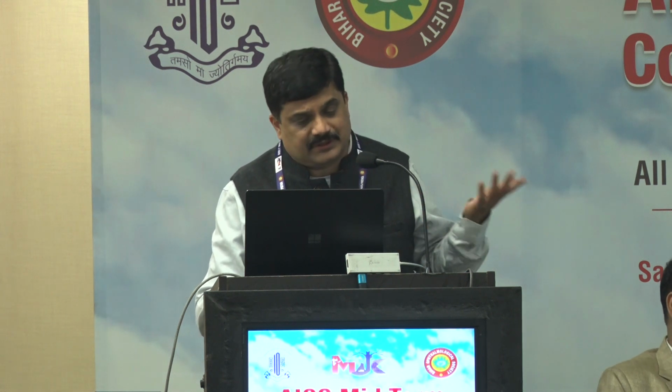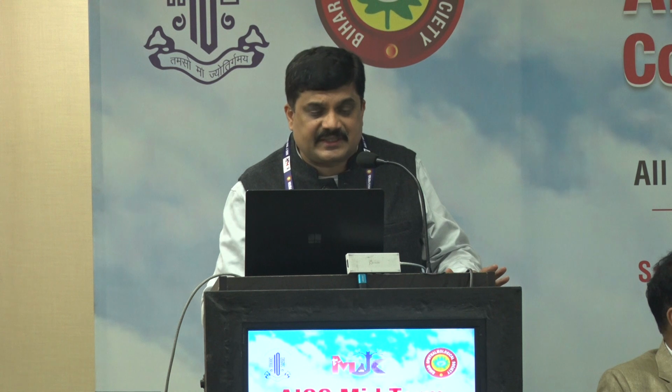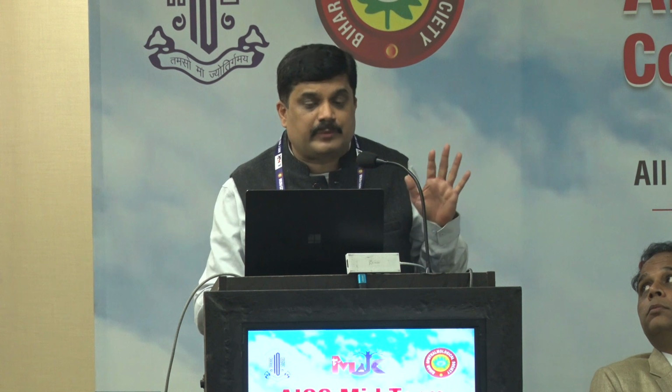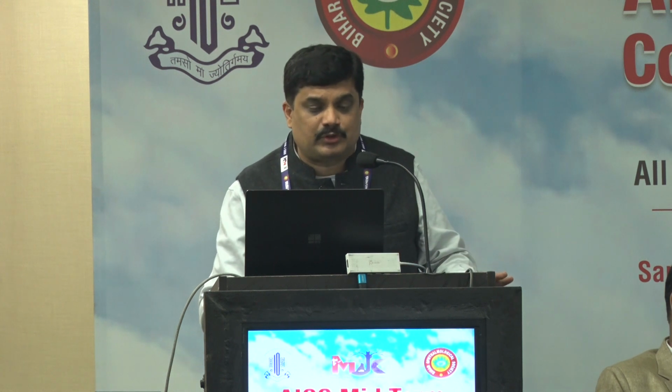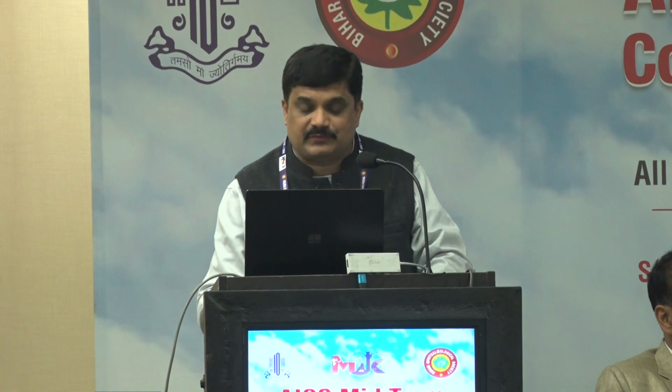There are two types of keratometer. One is manual keratometer, auto keratometer, and also with the help of topography, either Placido disc or elevation based, you can know the keratometry. So manual keratometry has two principles, basically fixed object and variable image size, and also fixed image and variable object size. Coming to the automated keratometer, most of us use this. The principle is it focuses the reflected corneal image from the central 3 mm zone onto an electronic photosensitive device which instantly records the size and computes the central 3 mm zone radius of curvature.